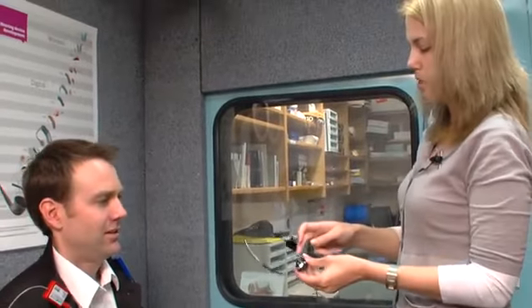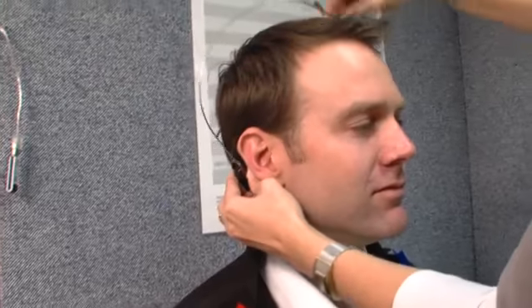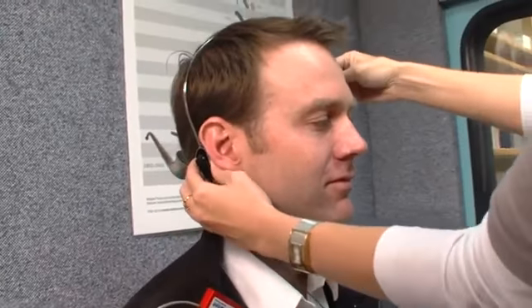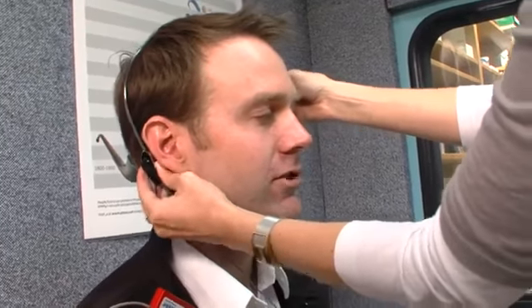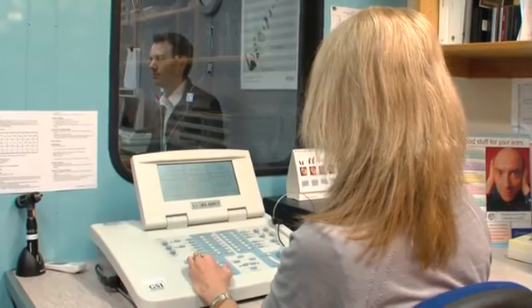All right, you're doing well so far. What we're going to do this time is put this headband on, and this little box just sits on the bone behind your ear. So all you need to keep doing is exactly what you have been doing. So just pressing that button whenever you hear the beep. Sure. This time you could hear it in either ear. In the case shown here, the site of lesion is found to be the cochlea itself, rather than the middle or outer ear.